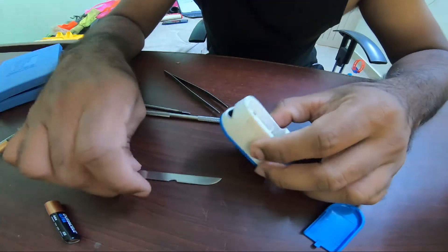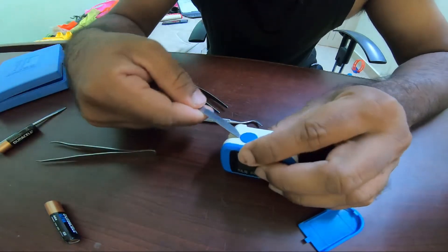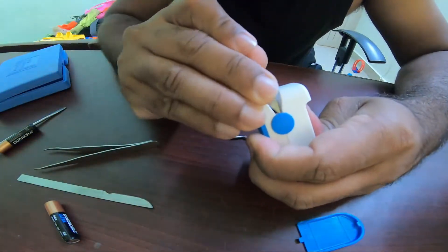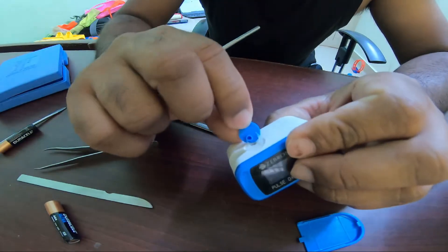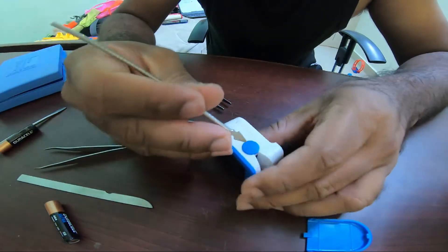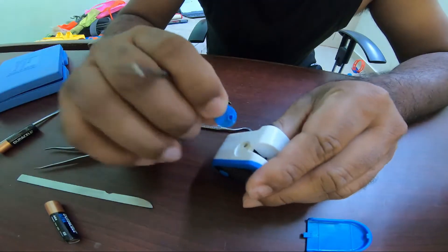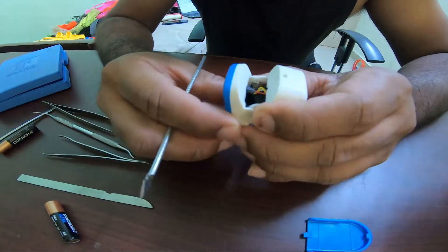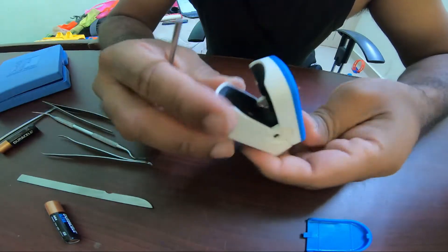Let me first try to remove the side cover. It's just a sticker which locks here — remove it and keep it safe. Now you need to take off the pads.